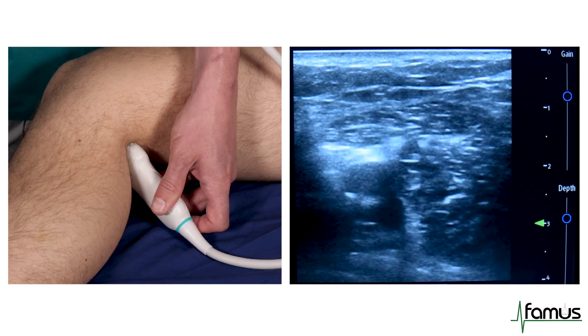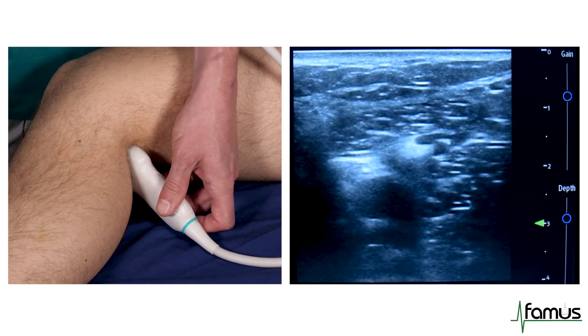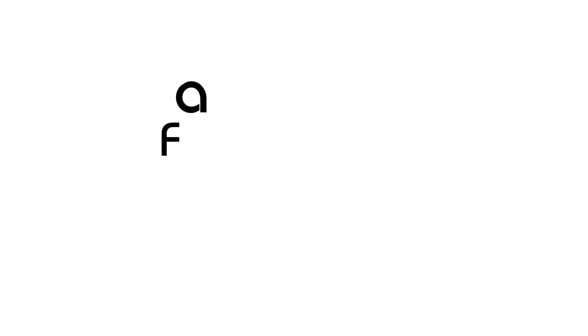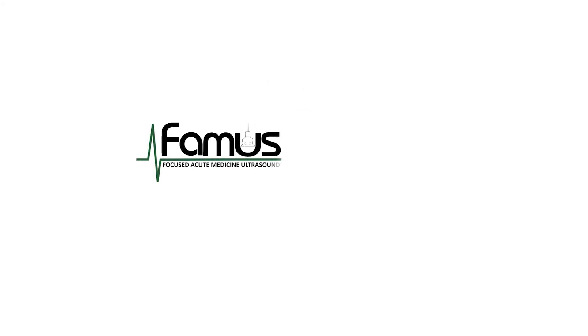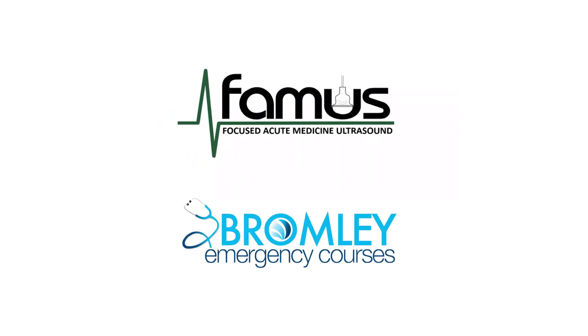And this completes the three-point DVT rule-in scan.